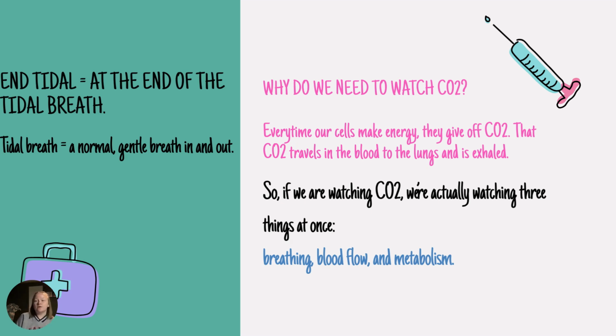So why do we monitor CO2? Every time our cells make energy, they give off CO2. That CO2 then travels into the blood, to the lungs, and then is exhaled. So while we're watching CO2, we're actually watching three things at one time: breathing, blood flow, and metabolism.